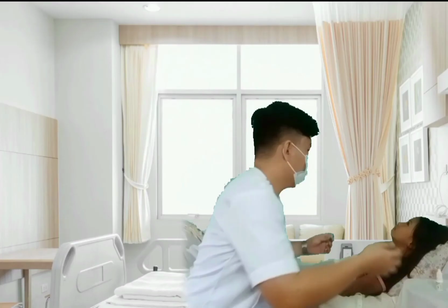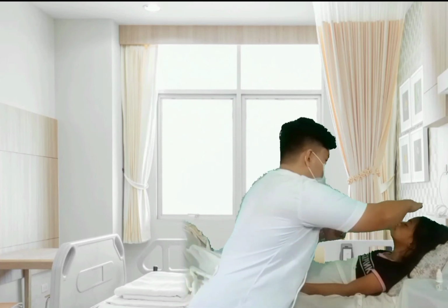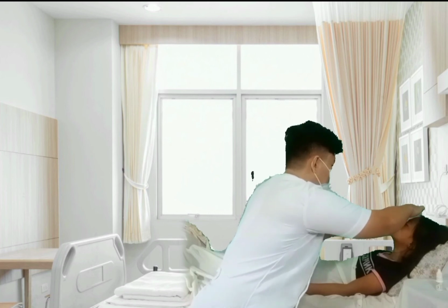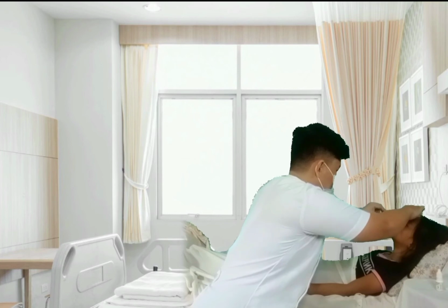Step 11. Ask the patient to breathe through the mouth, hold the tip of the nose up, and place the dropper just above the nares, about 1/3 of an inch. Instill the number of drops in one nares and then into the other. Protect the dropper with a piece of soft tubing if the patient is an infant or young child. Avoid touching the nostril with the dropper.